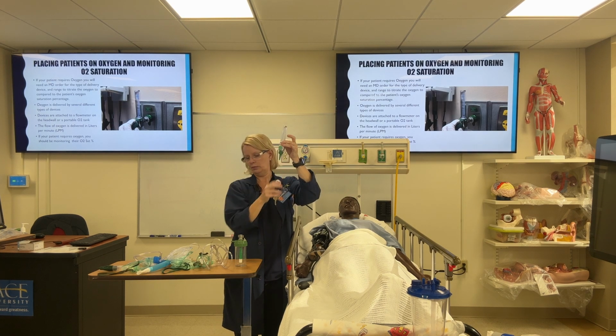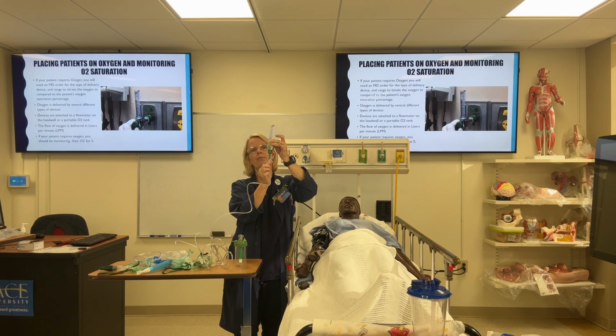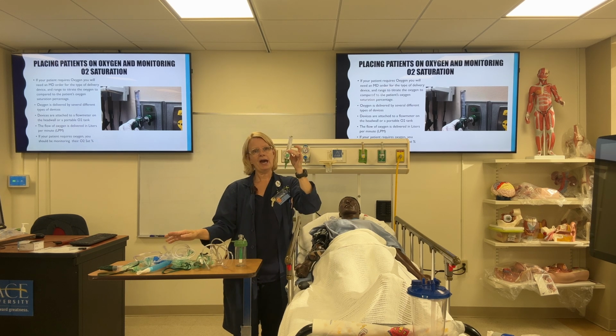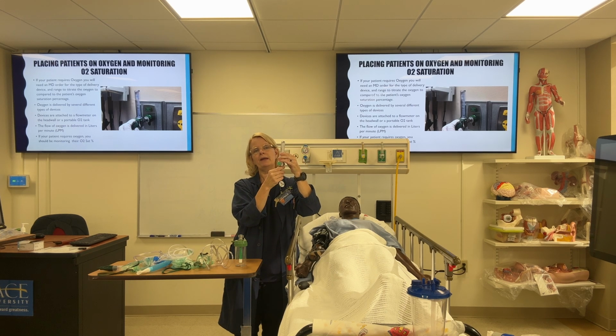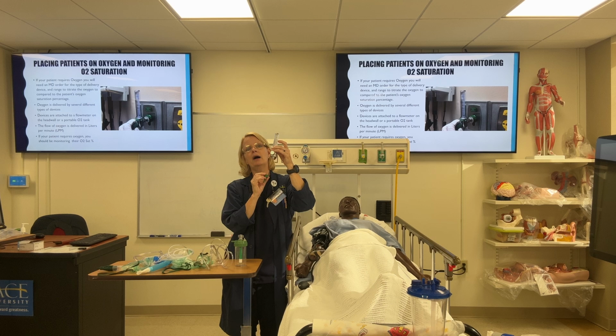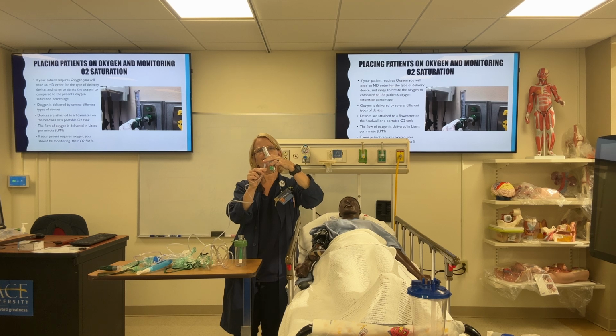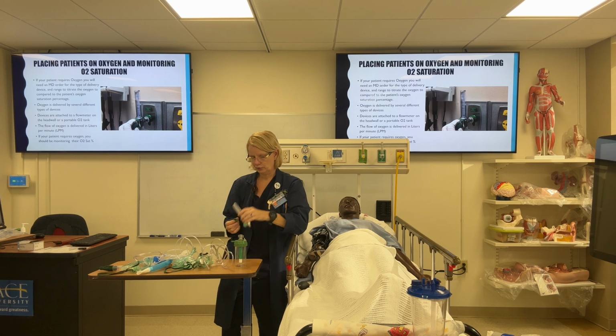And then that allows you to connect tubing that may be too skinny to actually put on the bottom of the flow meter. Now, that's kind of old school, so if you're working in an old place and maybe they buy old tubing, you'll be using a Christmas tree. Back in the old days, everybody would steal each other's Christmas trees and it was hard to find them, and you're constantly running around like, I need a Christmas tree, I need a Christmas tree. Nowadays, somebody got smart, and most of the tubing now, they actually made the base of the tubing fat enough to fit over the base of the flow meter. So it really depends on where you work, but you may hear the term Christmas tree, you may need that little adapter if your tubing doesn't fit. So I just wanted you to be aware of that.